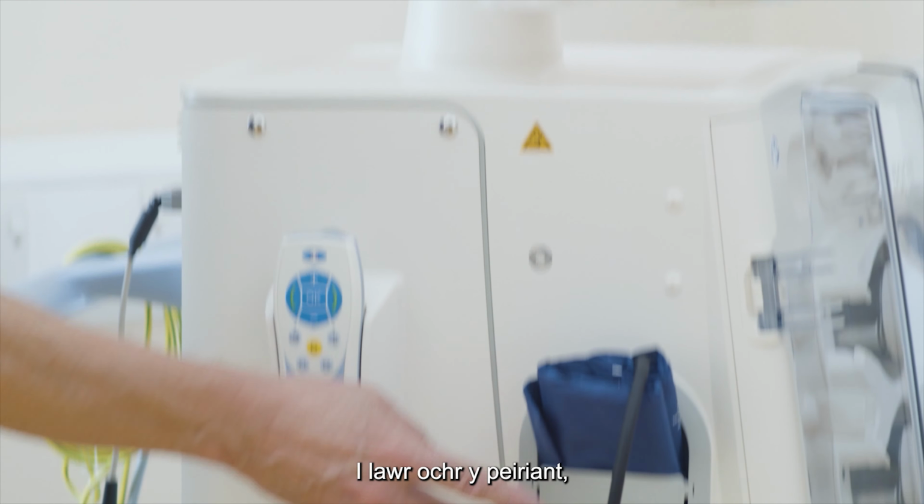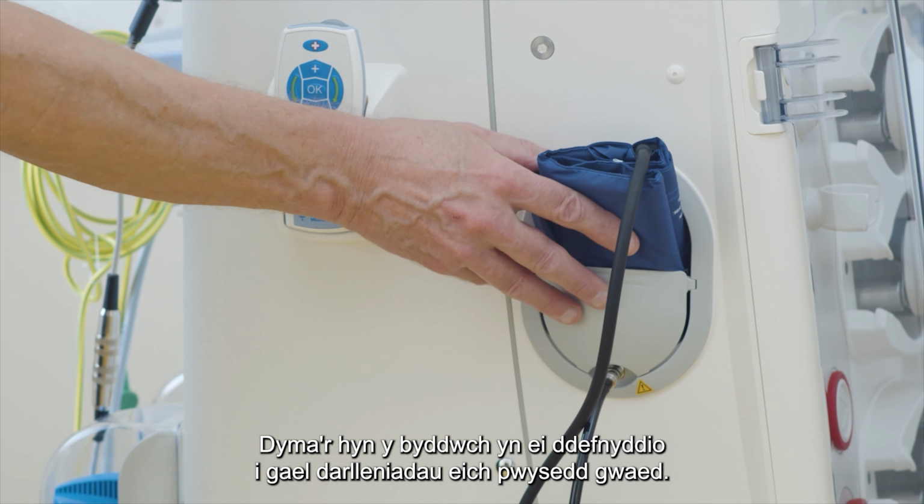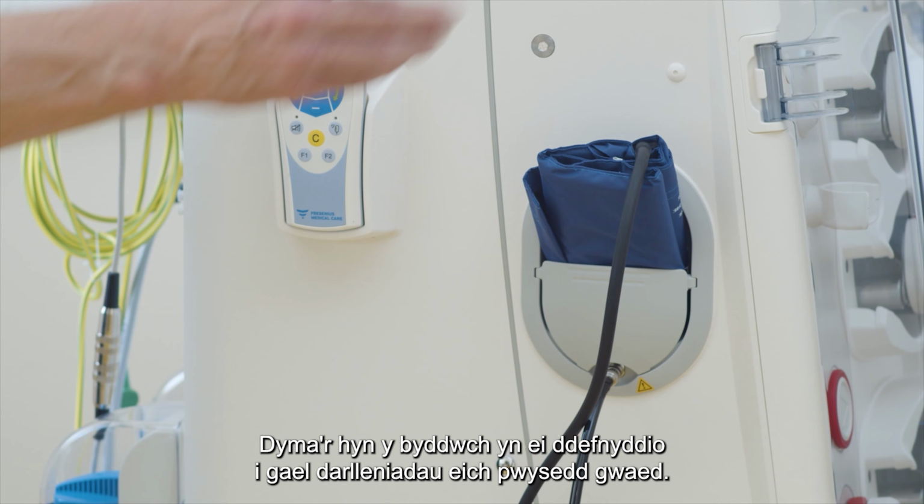Down the side of the machine, this is the holder for the blood pressure cuff. This is what you use to get your blood pressure readings.